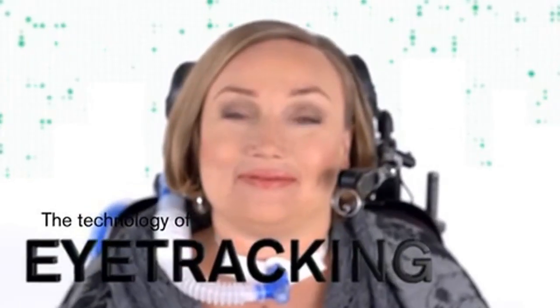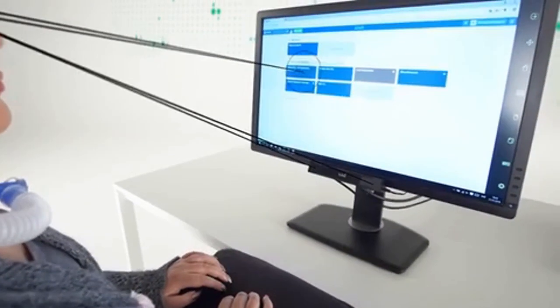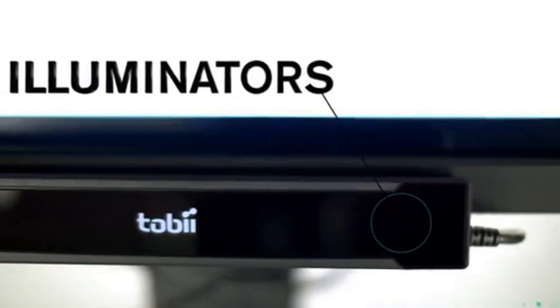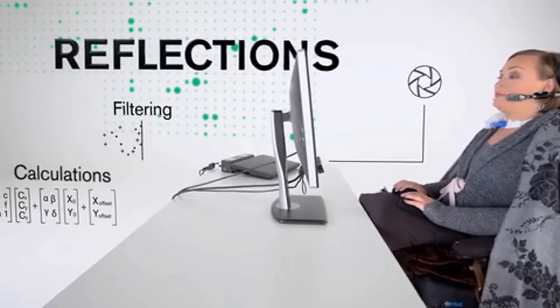Eye tracking is a technology that is used to see where a person is looking on a computer screen. The technology can also be used to control a computer. Instead of using a traditional keyboard and mouse, you control it by using your eyes. Illuminators in the eye tracker send out near-infrared light that is reflected by your eyes. A camera registers these reflections, and through filtering and advanced calculations, we can determine where on the screen you are looking, and then place the computer cursor consistently and accurately.